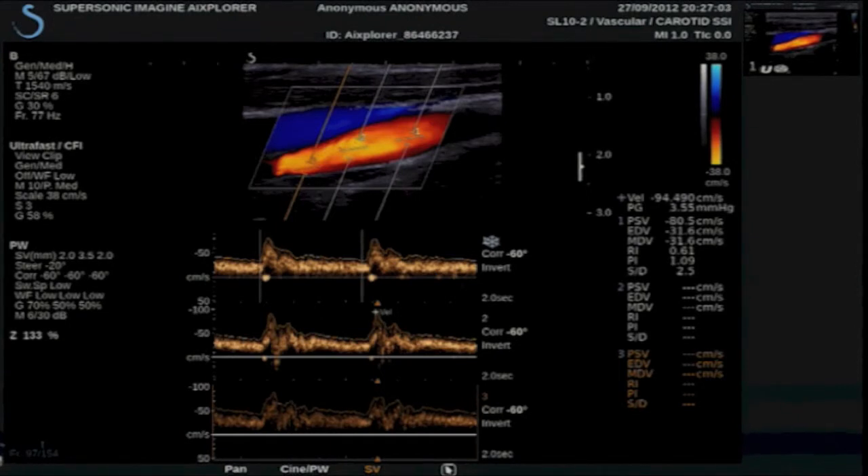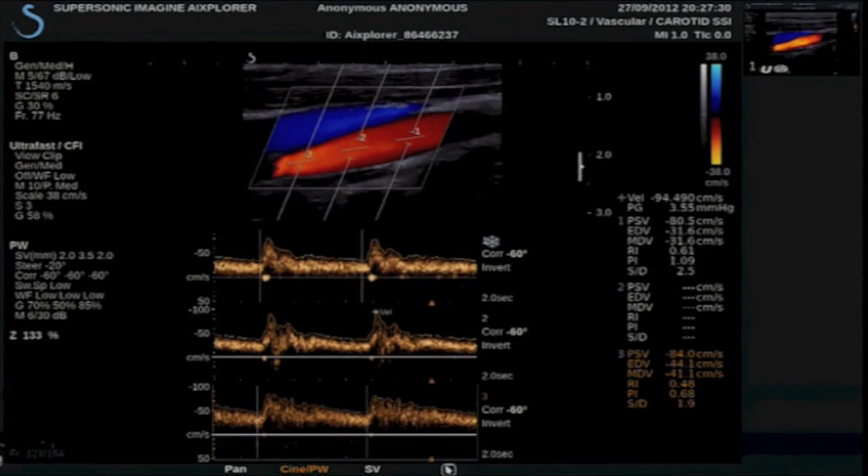Here we have three spectrograms with measurements listed on the right. Placing autotrace — and here are our measurements. I am going to play the cine loop after these three spectrograms. As I play the loop, you can appreciate the exact synchronization of the arterial flow with the color flow information throughout the cardiac cycle.